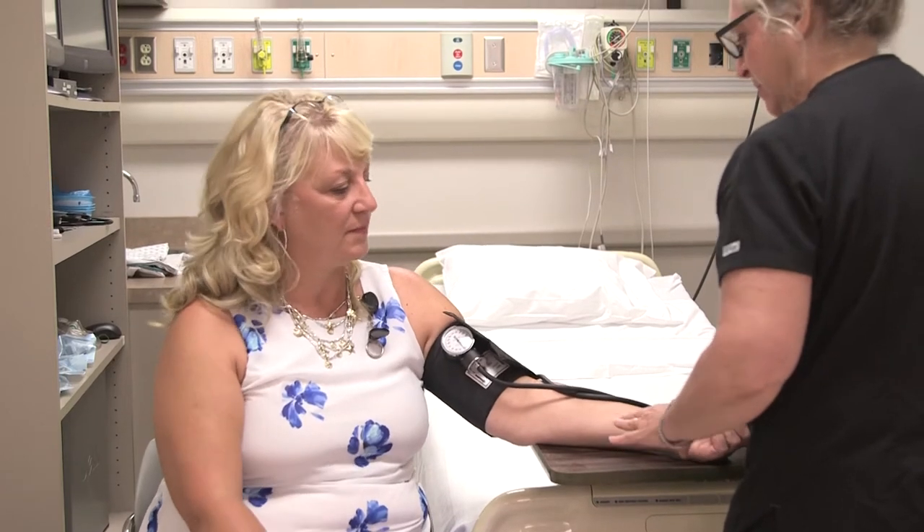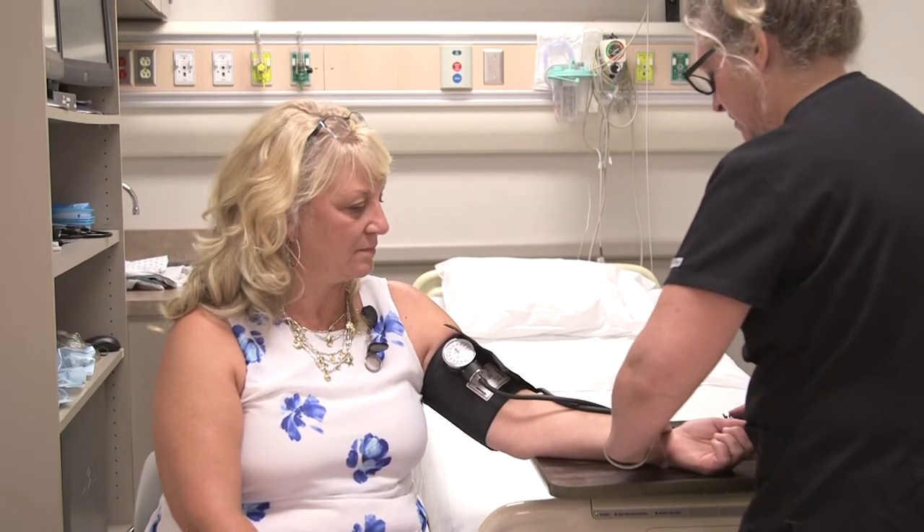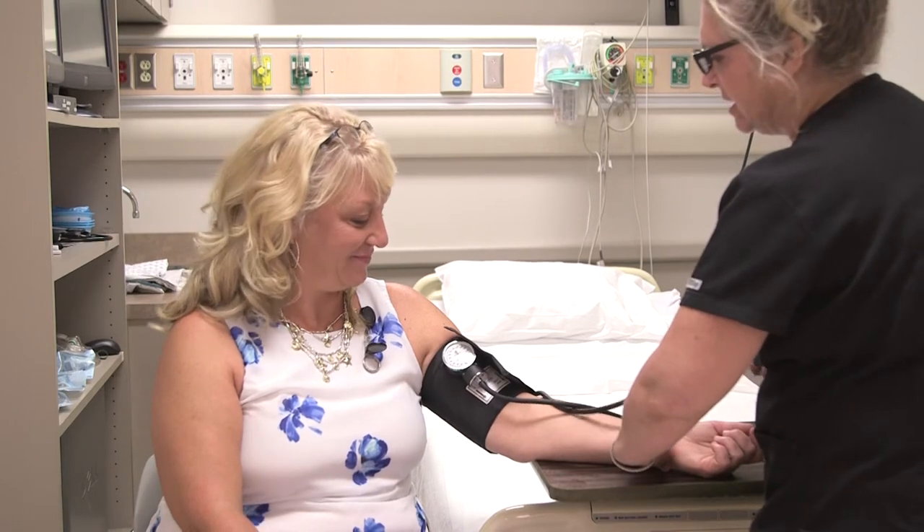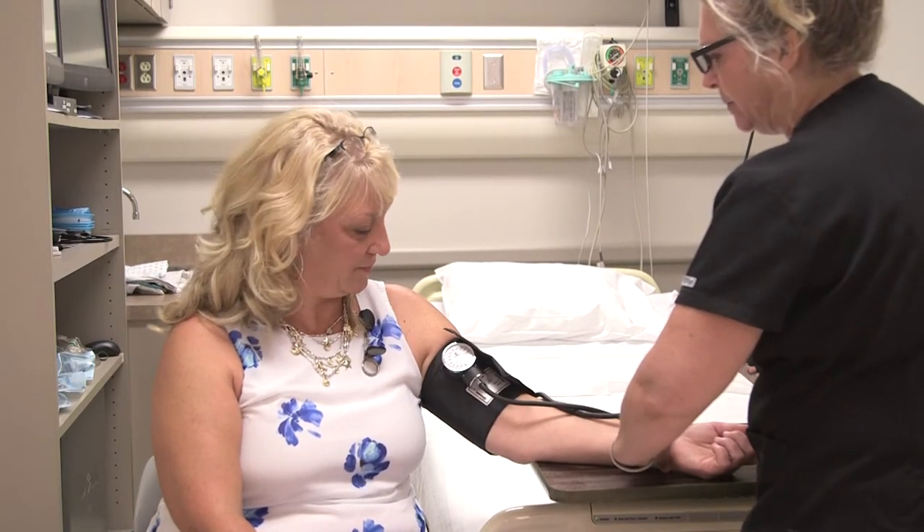It's important to do the right measurement on the arm because we want to make sure we get an accurate blood pressure. So first, I'm just going to feel your pulse. You have a really nice pulse there. And I'm just going to get an idea of where your blood pressure is running.